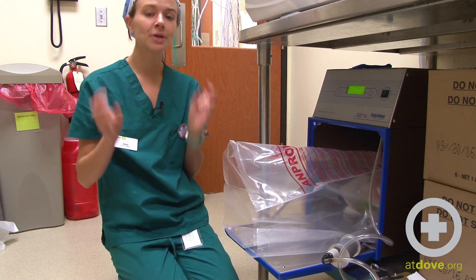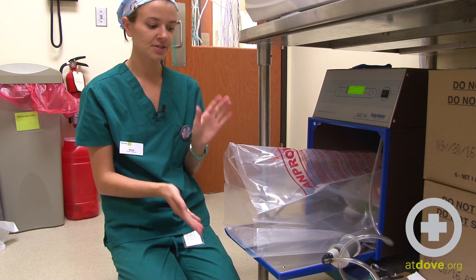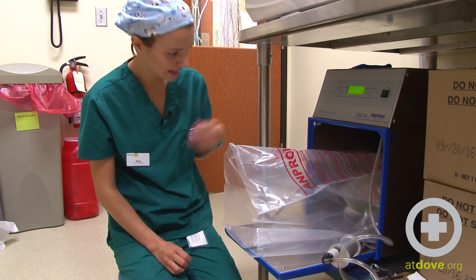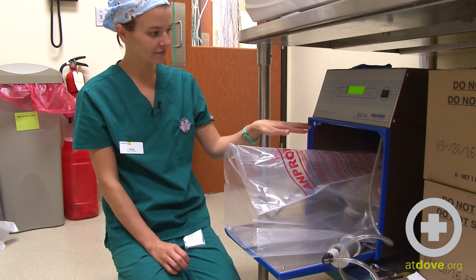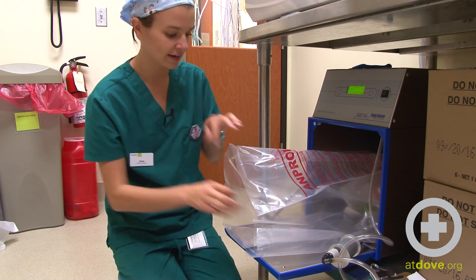I'm not going to open the ampoule yet — I do that by breaking the tab off the end. I'm going to wait until the sterilizer is closed and the bag is purged before I do that. So I'm going to leave the ampoule on top so I have access to it so I can open it through the bag.